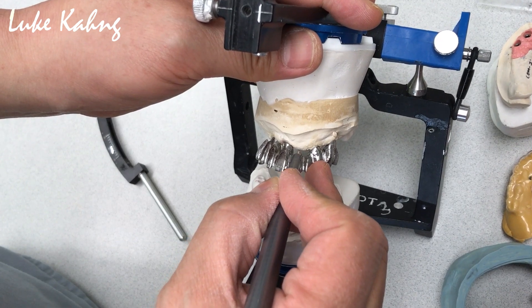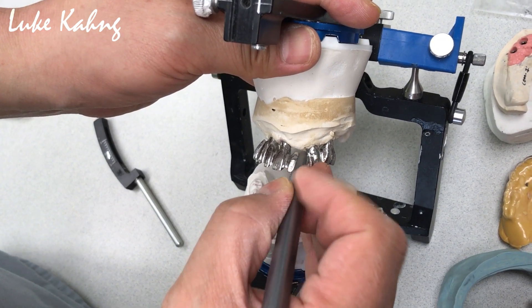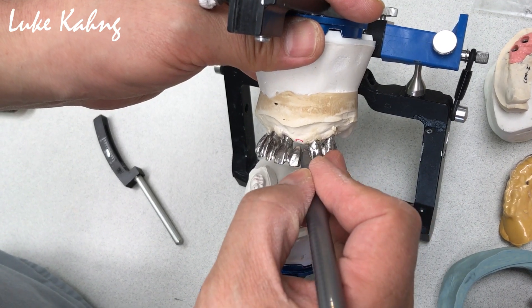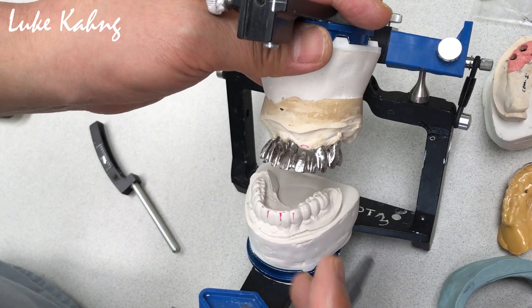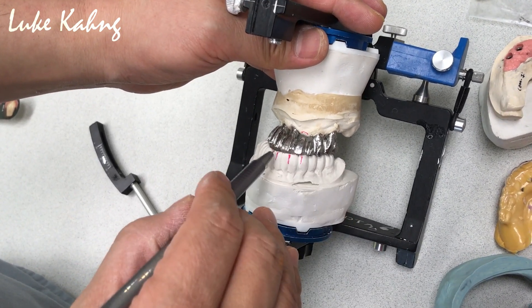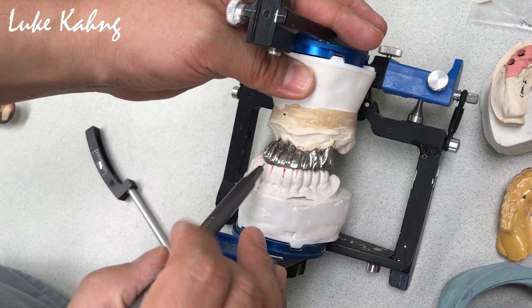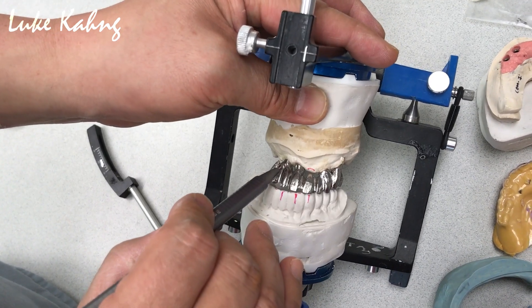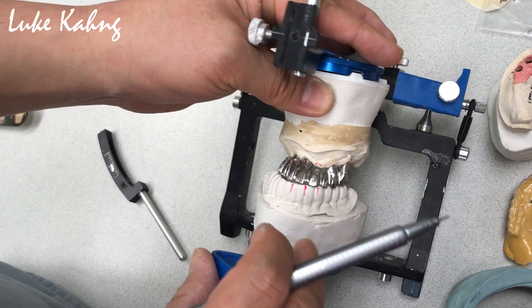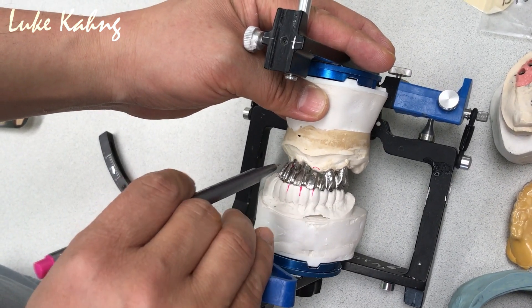It's necked, but we can make it slightly a little bit longer. And then this is what the final will be. Maybe here a little bit too. Lateral is good, size is good, lateral is okay. And the canine — you said this is 0mm, or 0.2mm. This is great for the buccal corridor.